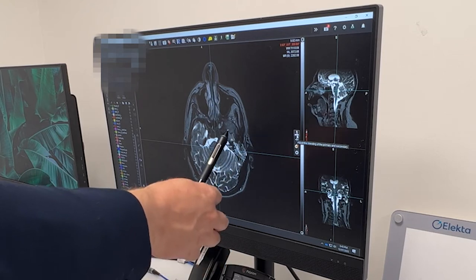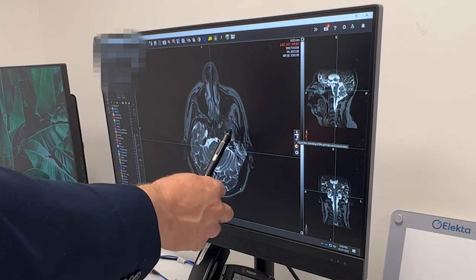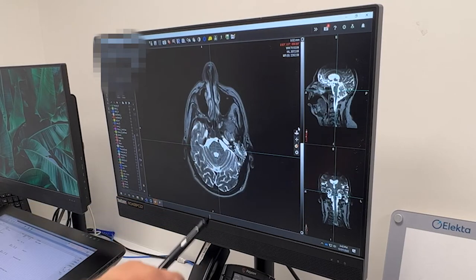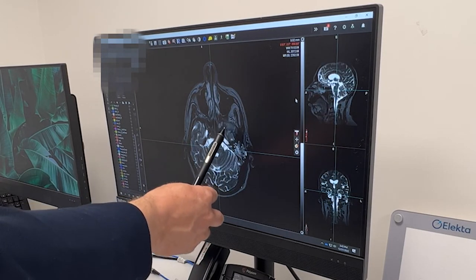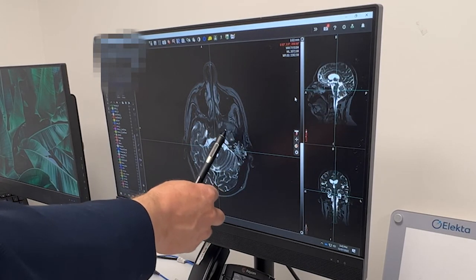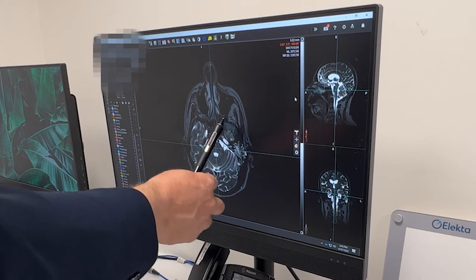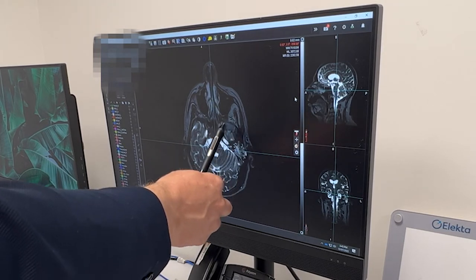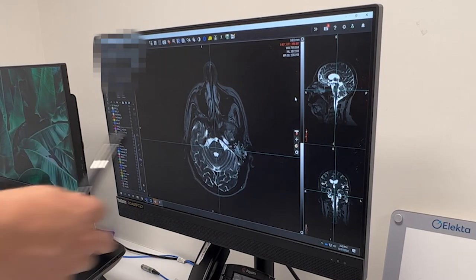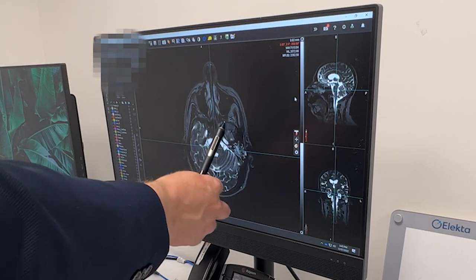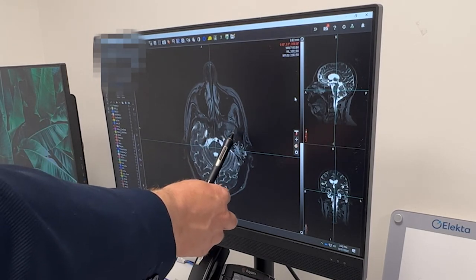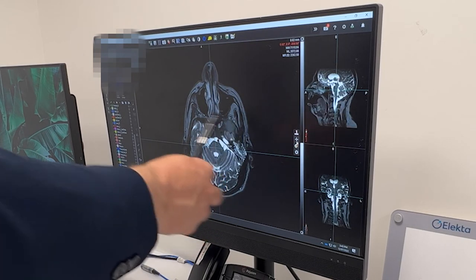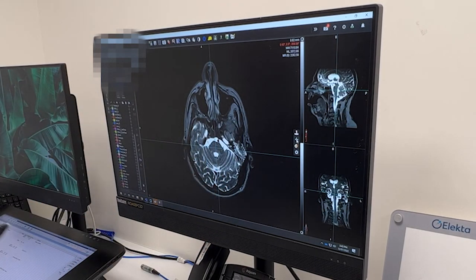We can see this tumor shrinks as treatment goes on. Nearly three weeks into treatment, that tumor has got much smaller. So we can actually change the shape of the area that we're treating to the high dose, but we can be very sure that the tumor remains within the area we're wanting to treat. So that's three weeks into treatment.